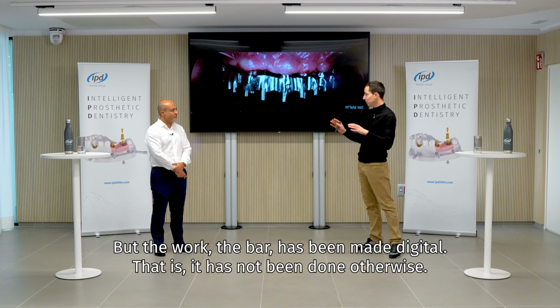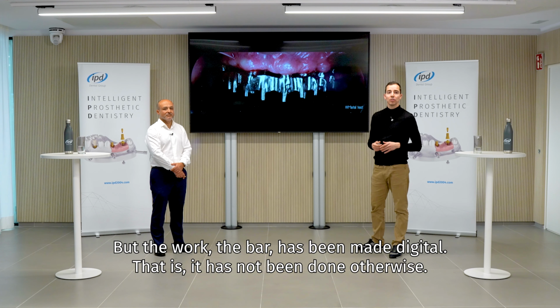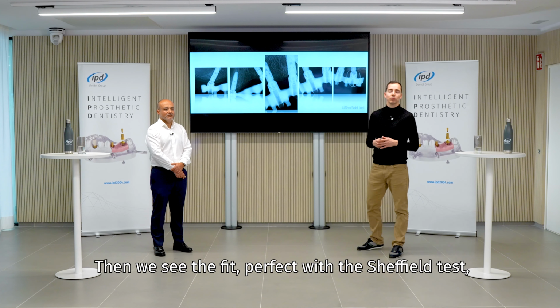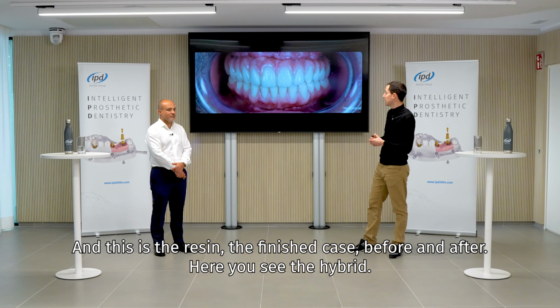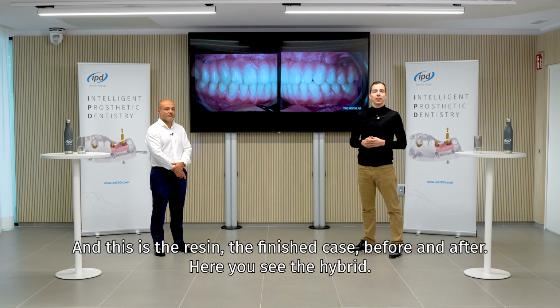But the work, the bar, has been made digital. That is, it has not been done otherwise. Then we see the fit, perfect with the Sheffield test. And this is the resin, the finished case before and after. Here you see the hybrid.